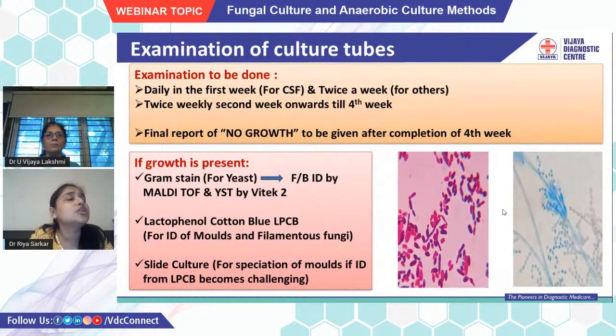After the inoculation, the tubes are incubated at 37 degrees Celsius and then we have a protocol to examine these tubes. For CSF, we examine these tubes daily in the first week. For other samples, the protocol is to examine the tube twice a week. This twice weekly examination continues till the 4th week, and a final report of no growth is only to be given after completion of the 4th week.